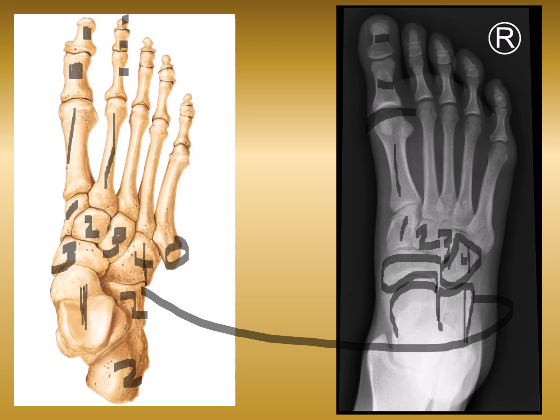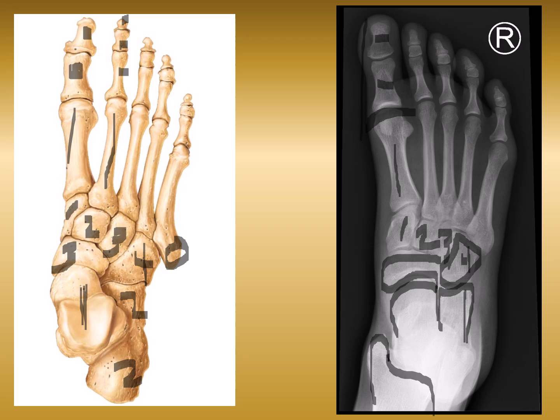Also, let me take this off really quick, and let's look at the malleoli. This is the tibia, all right? This is the medial side of the foot. Remember, our big toe is the medial side of our foot, right? So the tibia is on the medial side, and then the fibula is on the lateral side. So in our x-rays, we'll see at least 1 inch of the tib-fib, right? So we'll be able to see that medial malleolus and the lateral malleolus on our foot x-rays.